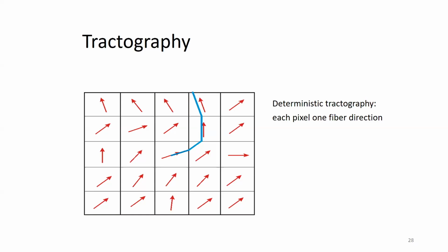This means that if I look at that voxel here, it can also be that this red direction, which is the main direction, is just the resultant of 2 other directions. So then I come to your question about the green and reddish colors. If I have fibers like this, which is very nice, and they are all together like this, they are parallel.